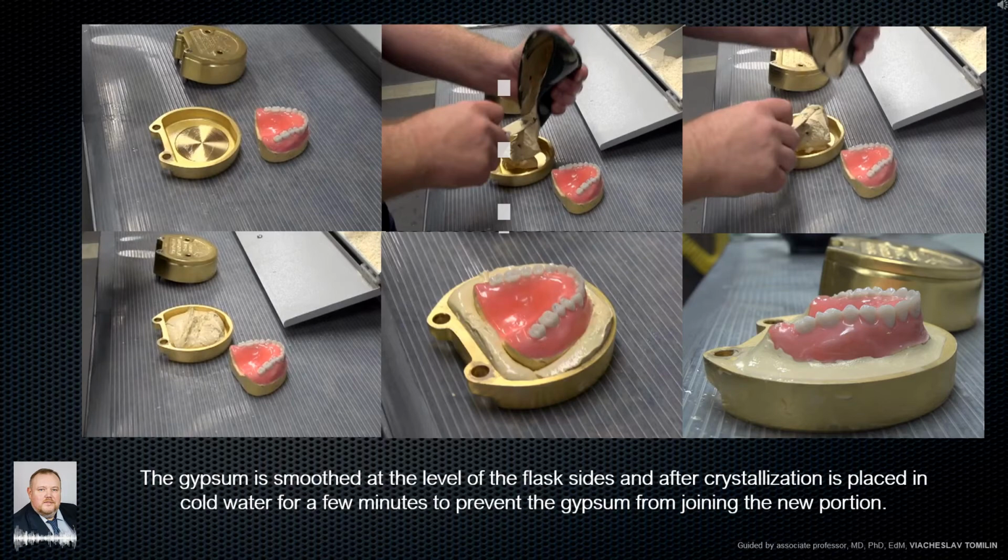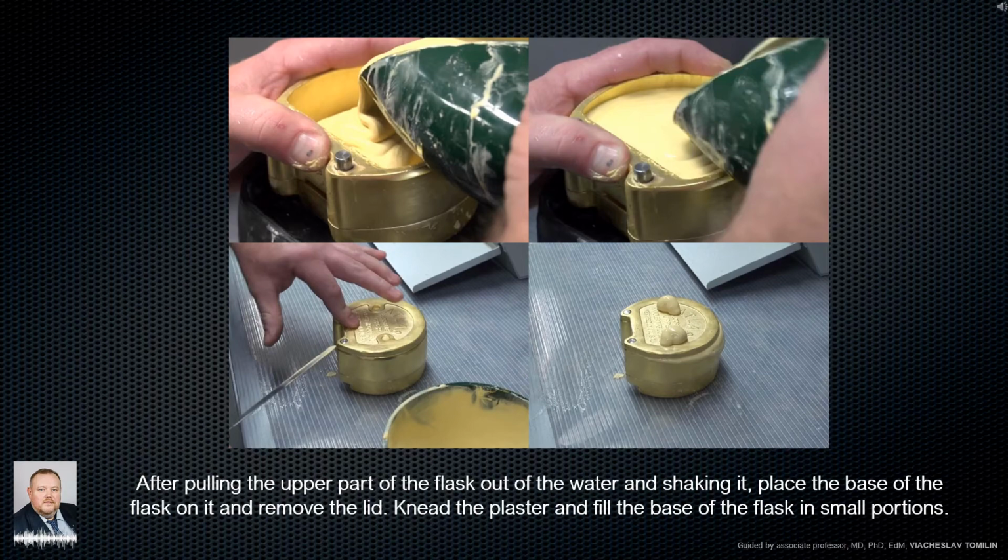The gypsum is smoothed at the level of the flask sides and after crystallization is placed in cold water for a few minutes to prevent the gypsum from joining the new portion. After pulling the upper part of the flask out of the water and shaking it, place the base of the flask on it and remove the lid.